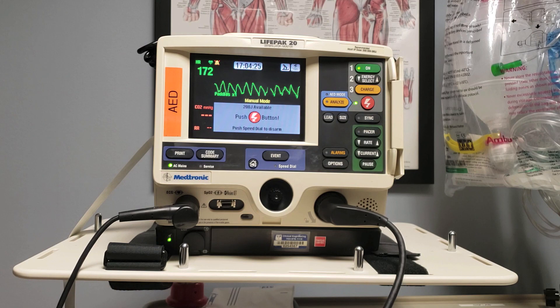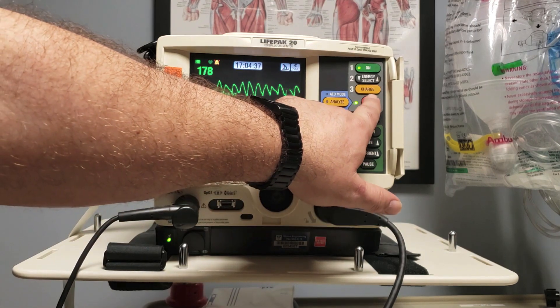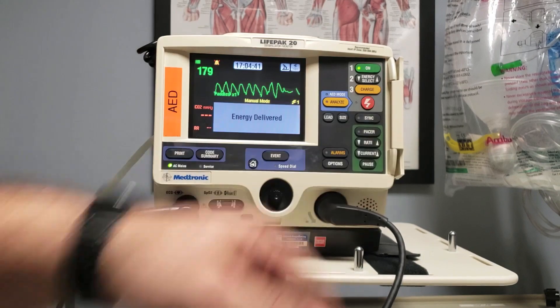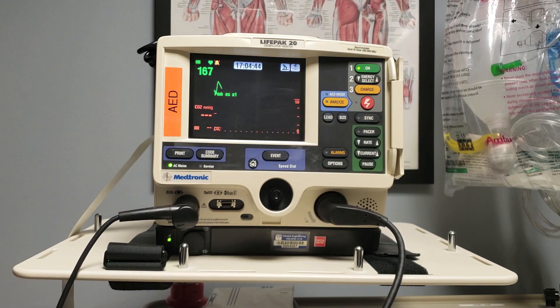Once it's charged, you're going to hear that alarm indicating it's available to shock, and it gives you the prompt to hit the correct button. This is the point where you need to say, 'I'm clear, you're clear, we're all clear,' and once everyone is off of and away from the patient and the bed, you're going to deliver that charge, and it will tell you that that shock has been delivered.